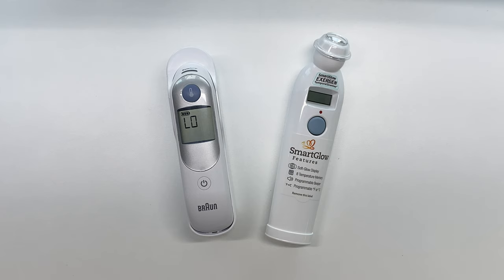Now when it comes to a thermometer and reading your temperature when you're sick, I would highly recommend you get something from a reputable company like these two. So let's go ahead and look at some of the key differences between the two.